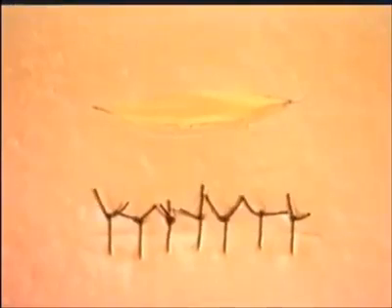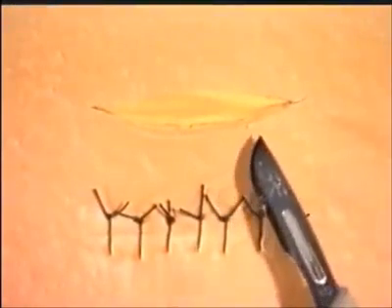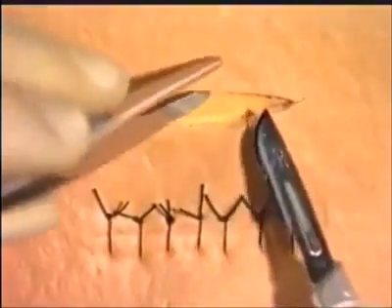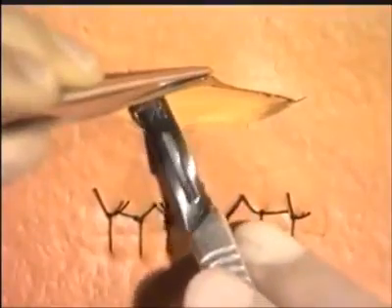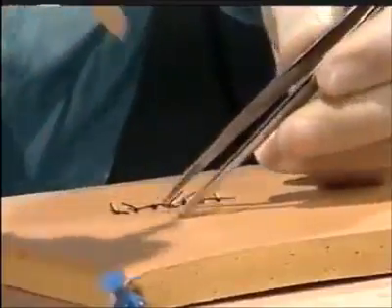Then, having completed that suture, again, halve the remaining wound, and continue as shown. It may not be possible to do this for an elliptical incision, and you may need to undermine the incision edges to increase mobility of the skin edge.